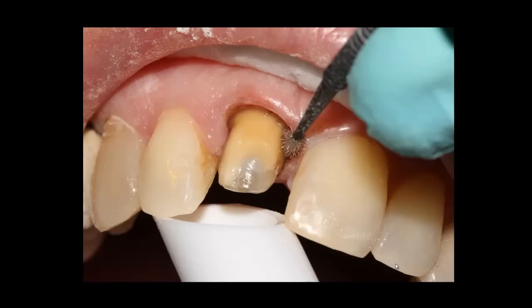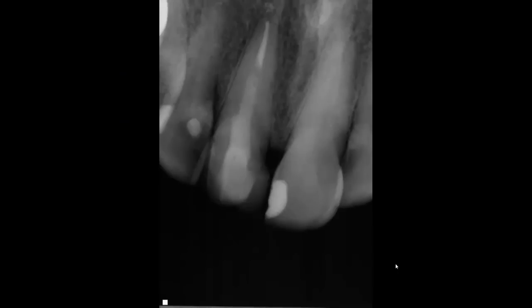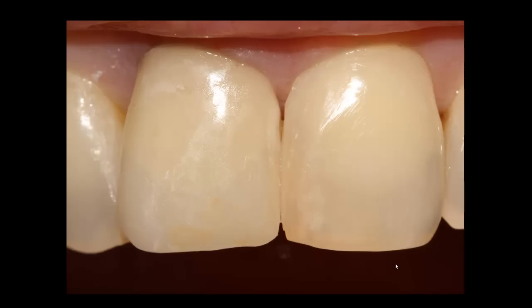When the bonding is done, I cement the crown and use a polishing piece to go around the tooth structure and around the crown to make sure there is no residue left from the cement. Here is the final X-ray and the final picture. Thank you very much.